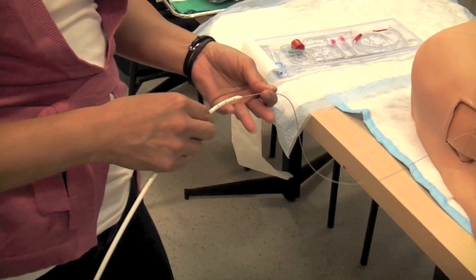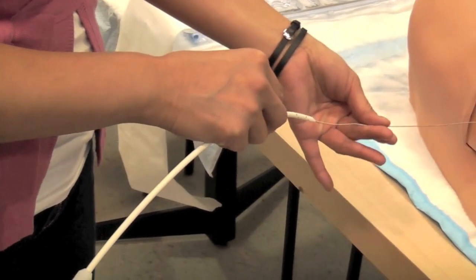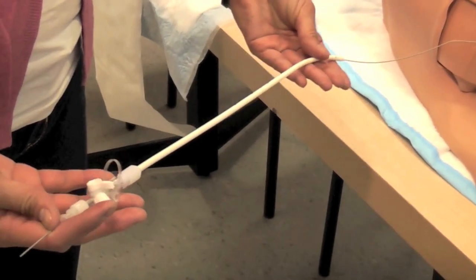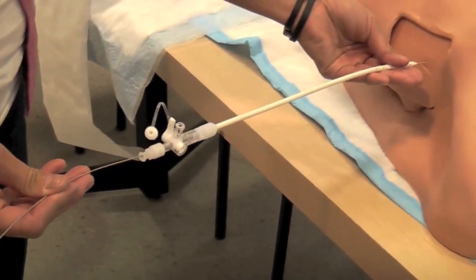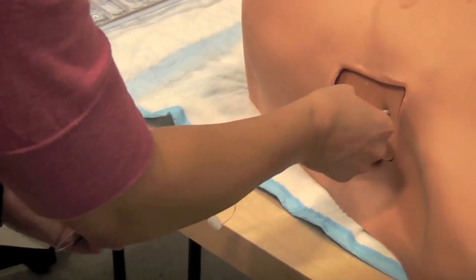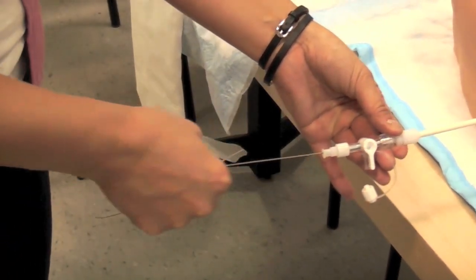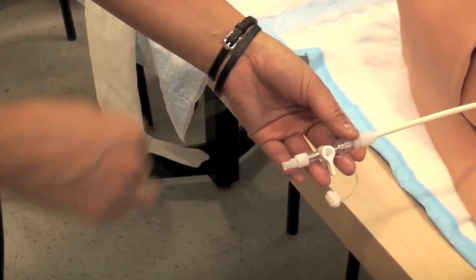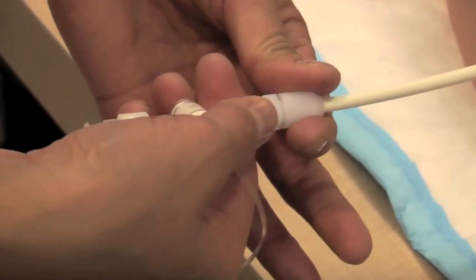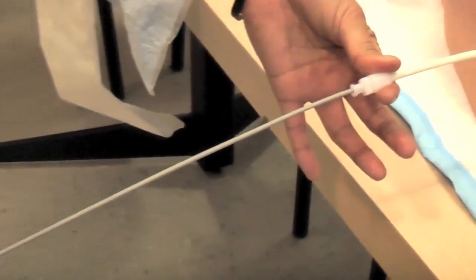The entire assembly is threaded over the guide wire. Ensure the guide wire end exits through the obturator. When inserting the pigtail into the pleural cavity, the obturator gives you some ability to guide the pigtail superiorly. Remove the guide wire, then remove the obturator and stopcock as a unit by unlocking the luer lock between the stopcock and pigtail catheter. The rest of the procedure is identical to before.